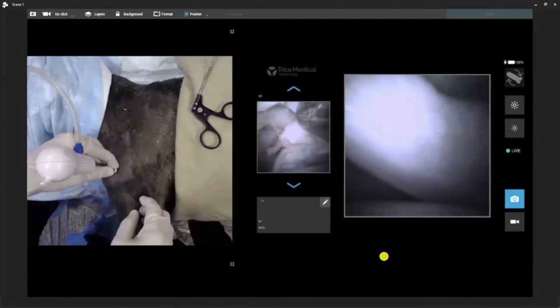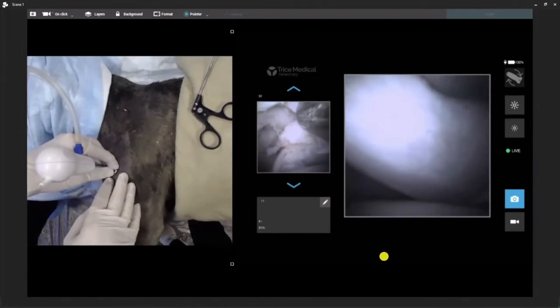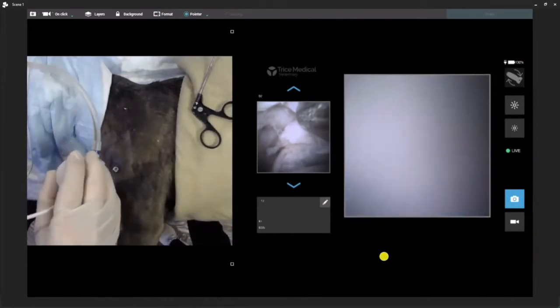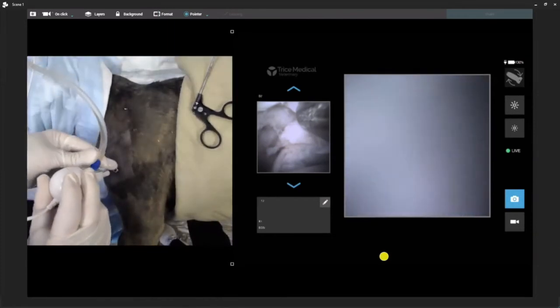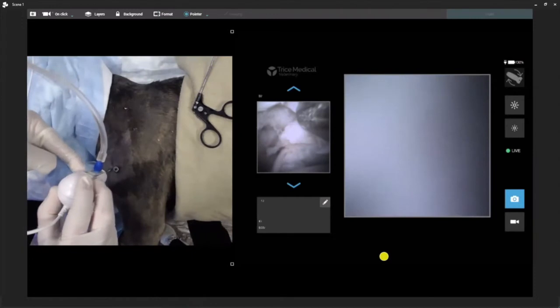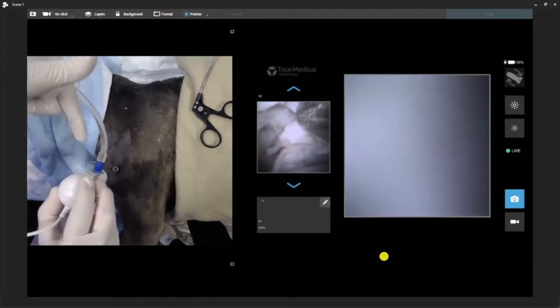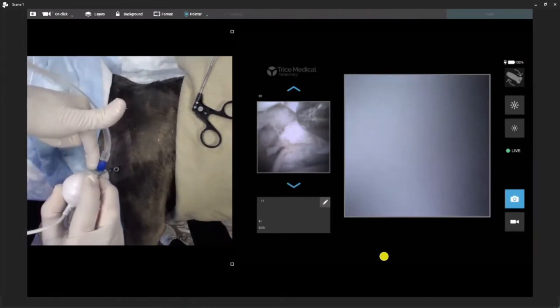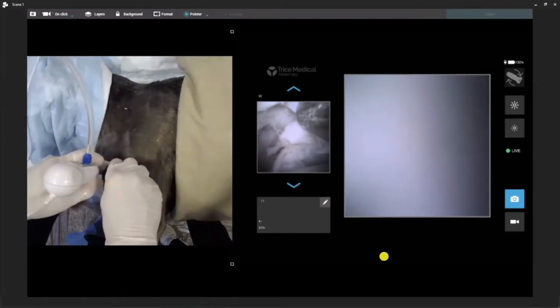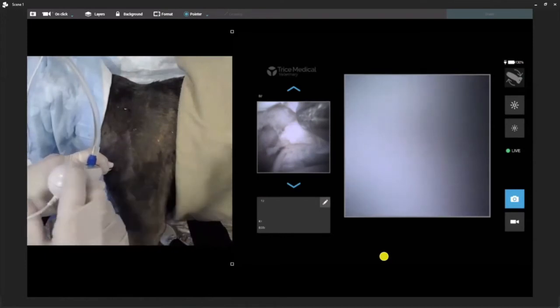So what we'll do now is slide out and go to the elbow. I'm going to turn my fluids off. The nice thing is you also have this injection port — say you want to follow this up with a PRP injection. We can call our fluids out, and since we know we're in the joint because we can visualize everything, we can connect our syringe with the PRP and go ahead and do your injection. That's another nice thing you can do as far as your post-scoping protocol.